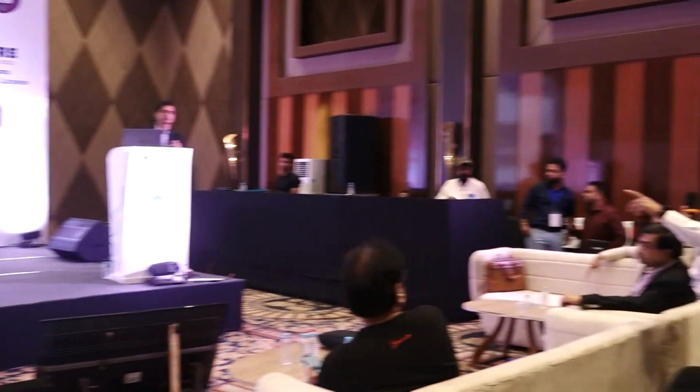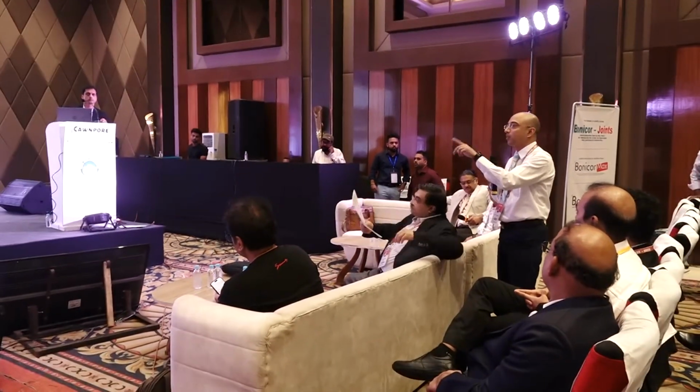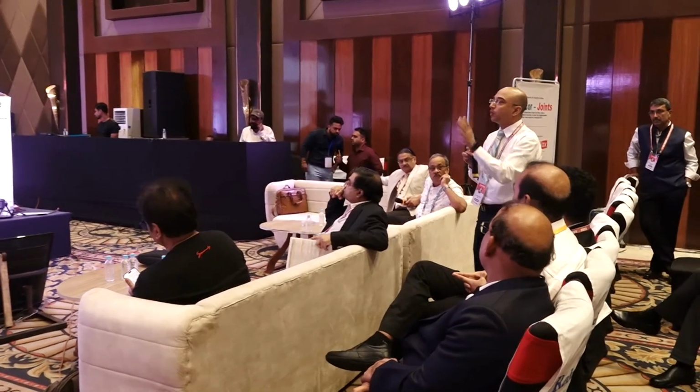Yeah, Sudeep, you want to say something? Yeah, you're right that you need a robot to actually control exactly, but you have to realize that everything is done in a position where the patient is not mobile, relaxed. So you should have a parameter. You need to at least look into the spine X-ray to start looking.